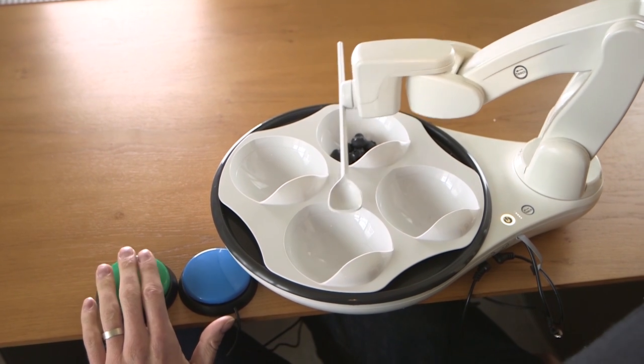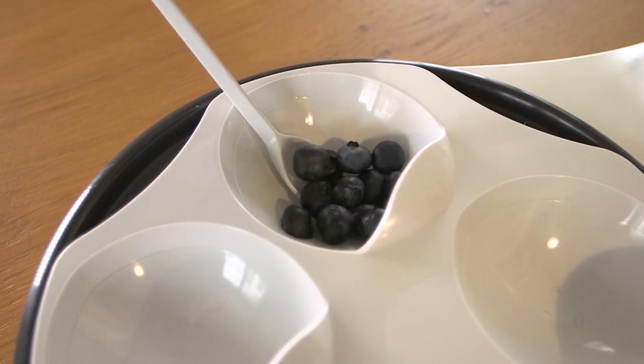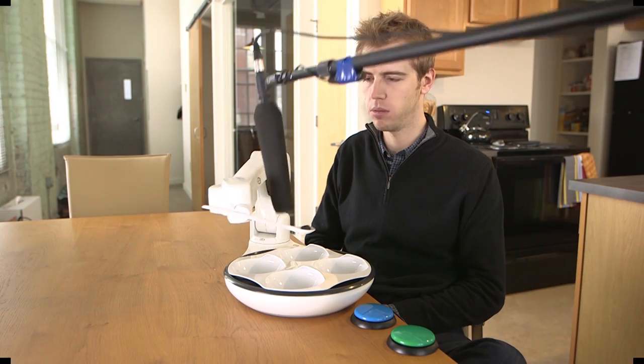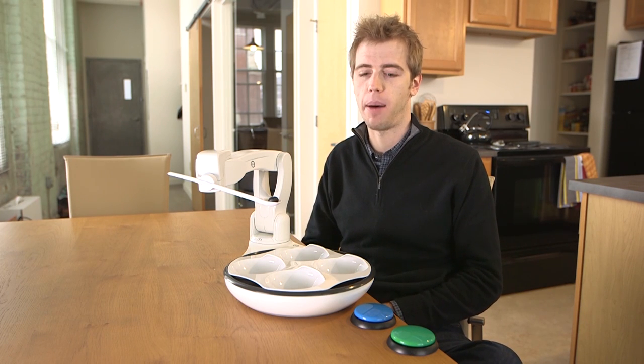You'll first want to press the choose button to select the bowl you'd like to eat from. When you're ready, press the delivery button. OB will scoop through the bowl and bring the food to your mouth. If anything unexpected were to happen, don't worry — OB will stop, back away, and wait for your command to keep moving.